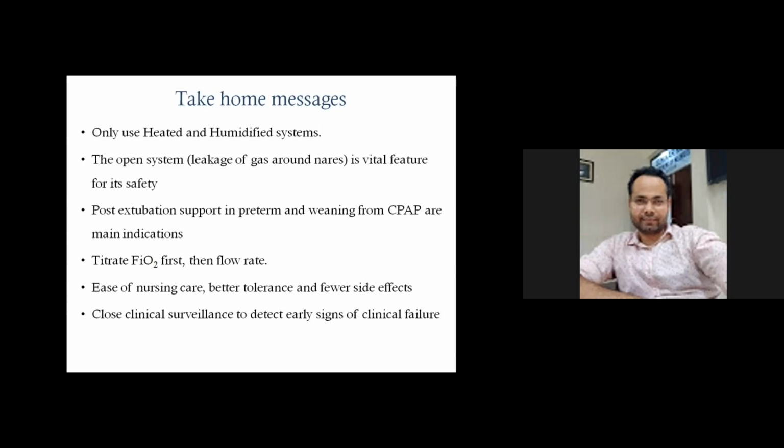Post extubation support in preterm infants, it can be used as a primary modality and also for weaning from CPAP. And we should always try to titrate FiO2 first and then the flow rate. HFNC provides ease of nursing care, has better tolerability in infants, and also has fewer side effects. Then we should always monitor. Close clinical surveillance should be done to detect signs of failure, such as acidosis or increased risk of hypoxemia, and switch the mode accordingly.